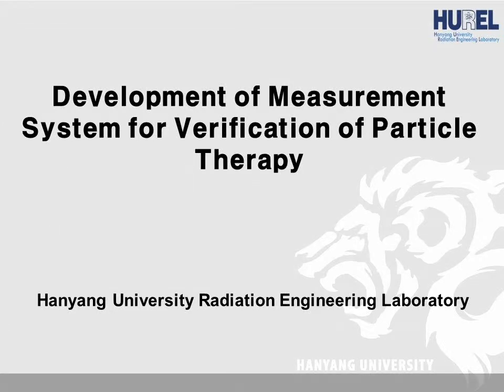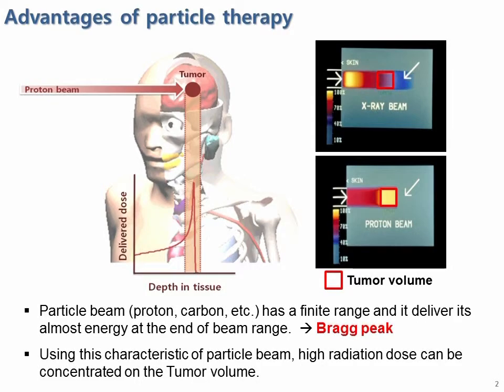This video is made to introduce our research to develop a measurement system for the verification of beam range and dose distribution in particle beam therapy. Compared to conventional radiotherapy, the particle beam therapy using proton or carbon beam has many advantages.